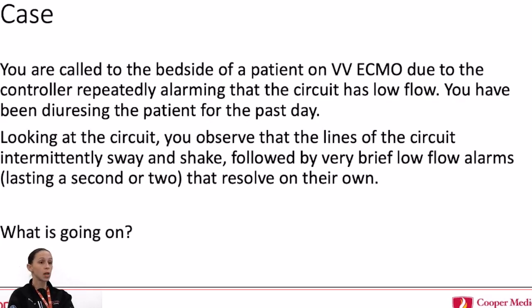If you're ever concerned about the positions of the cannulas, X-ray is helpful, and we can also ultrasound and try to get an answer on that. Just to contrast, we talked about both bright red, which would be an extreme case of recirculation. If they're both dark, venous looking, what does that mean? You're not oxygenating.